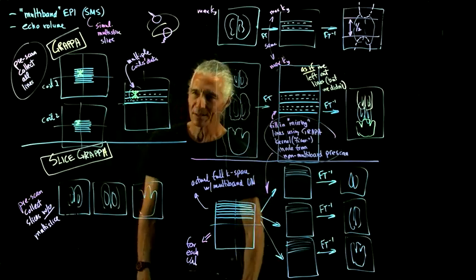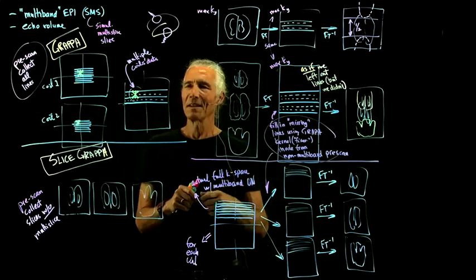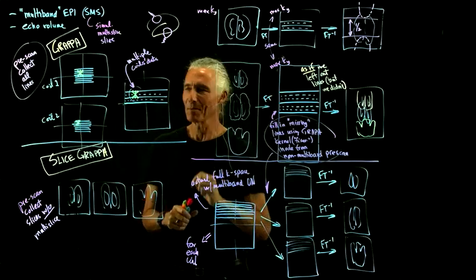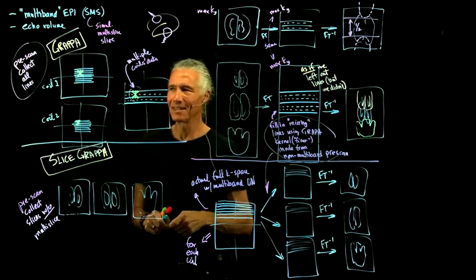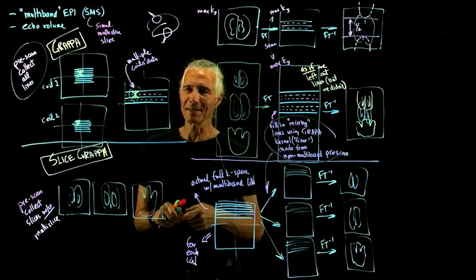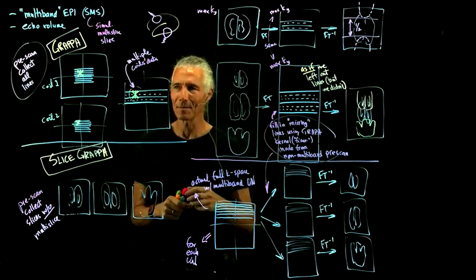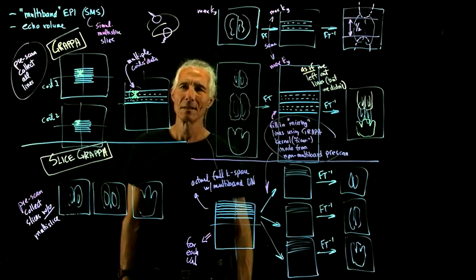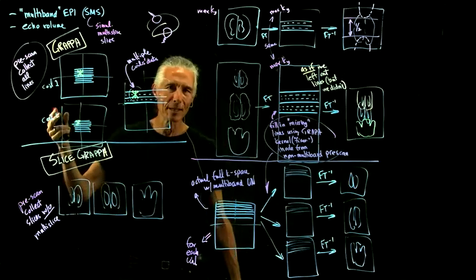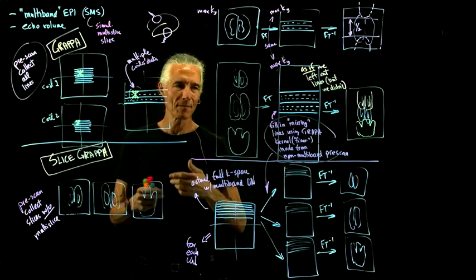And so I think it's important to understand how this procedure works, even though 99.9% of the people that use it don't. So you're going to be part of the 0.1% that actually understands how this is done, and why it requires multiple coils. Okay, so any questions about multiband, the most commonly used functional MRI sequence currently? In practical terms, not much to it. It just looks like a regular EPI scan, and you've got some extra blips, and some extra RF pulses that pile on top of each other.